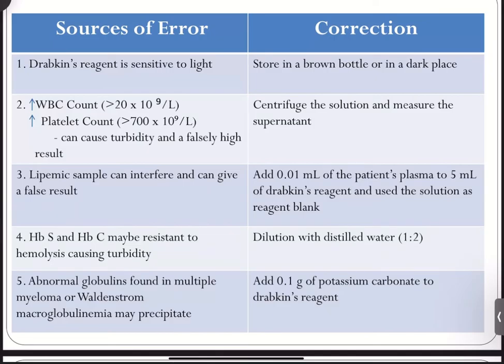Okay? Your high turbidity can affect the spectrophotometry, thus increasing the hemoglobin. Okay? This is being corrected using centrifugation. No? Then, lipemic samples can also interfere. How? No? Because of the turbidity also.